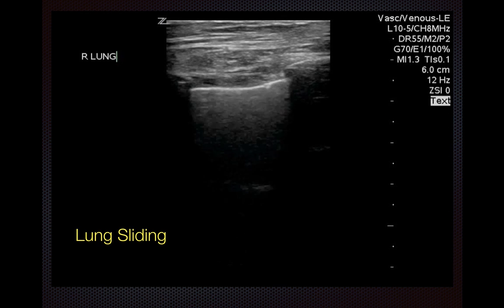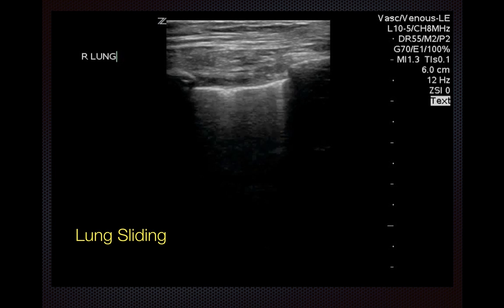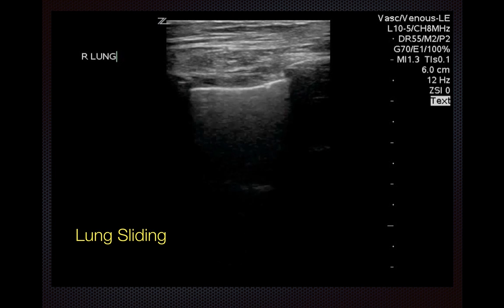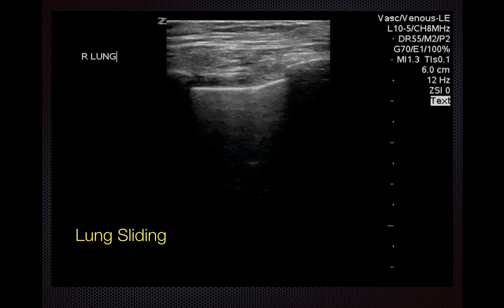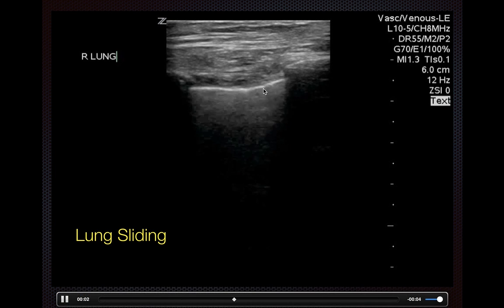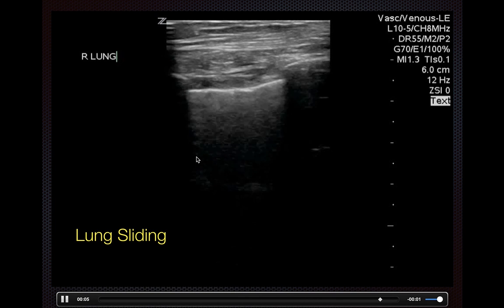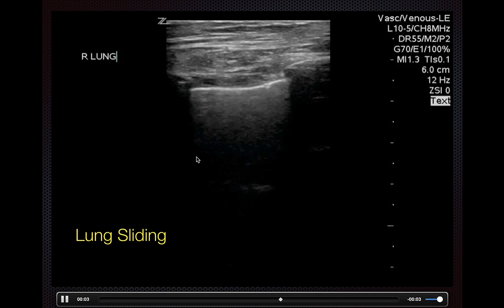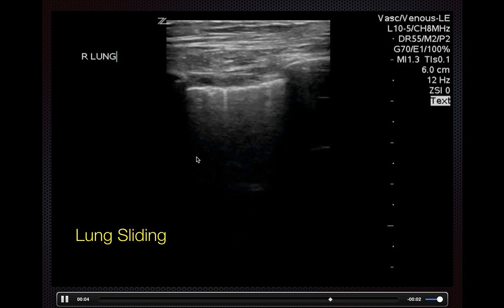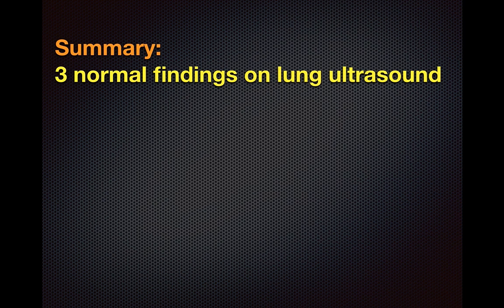The last normal finding to look for is lung sliding. You may need to decrease the depth slightly to see this better. As the patient breathes in and out, you can see movement at the pleural line — this movement is lung sliding and is entirely normal.